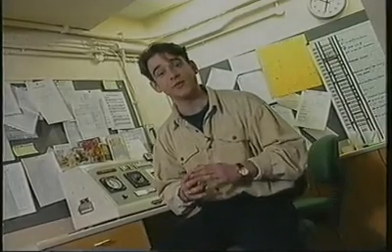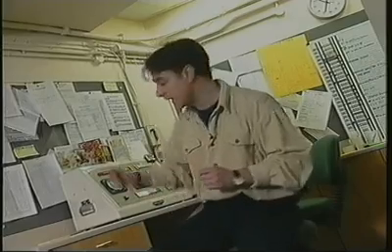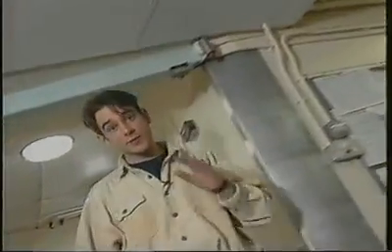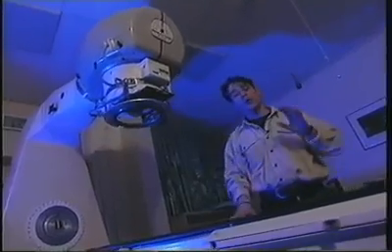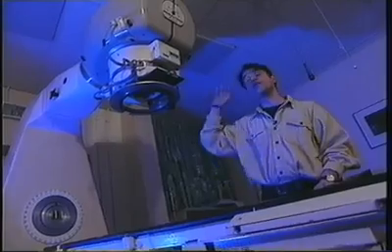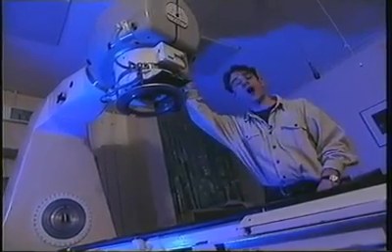We're now in the radiotherapy department, which contains the machines which are used to treat patients with cancer. Now, this is one of the older machines, but it's still useful for certain kinds of treatment. So let's go and have a look at it. Now, this particular machine is often used to treat breast tumours of the kind that we saw earlier, and it contains a piece of radioactive cobalt, that's cobalt-60, which fits into this head up here, and it's surrounded by heavy lead shielding. Now, when the machine is turned on, a shutter moves to expose the source, and the size of the field is controlled by a pair of diaphragms up here.